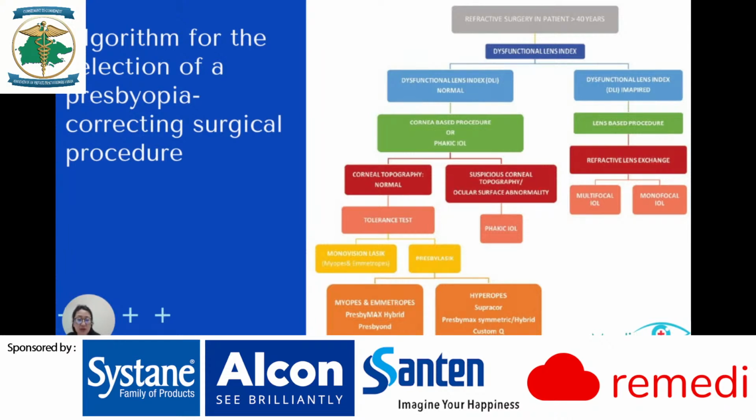If the patient has normal dysfunctional lens index, patients are usually counseled for a corneal-based procedure or a phakic intraocular lens.